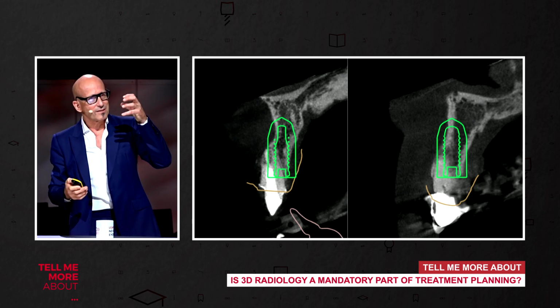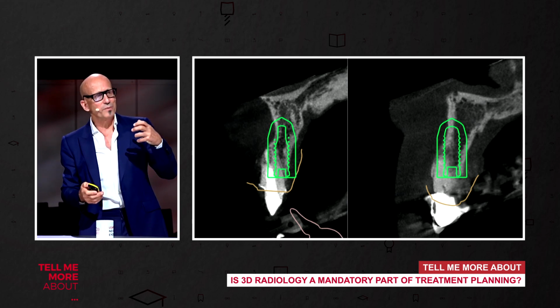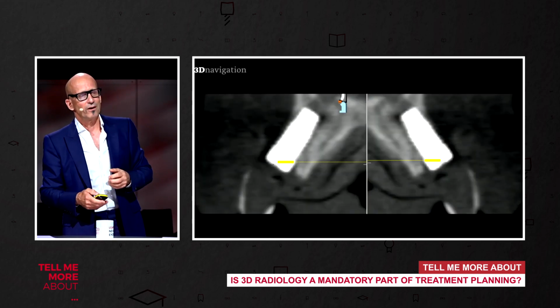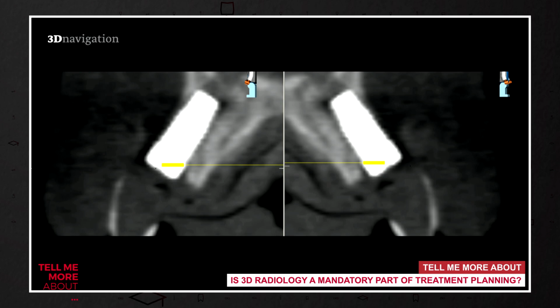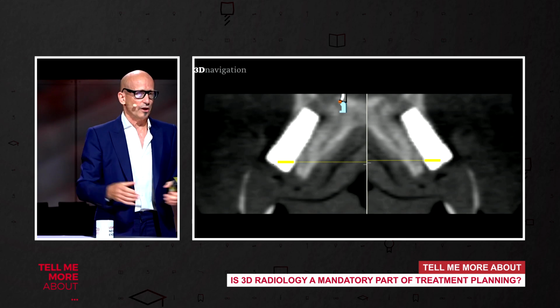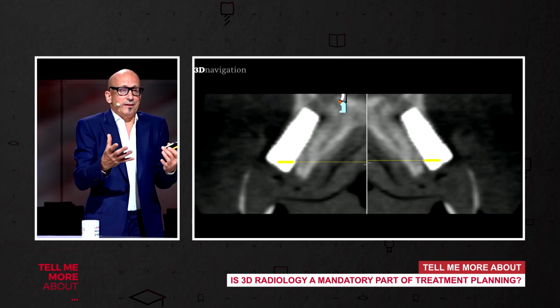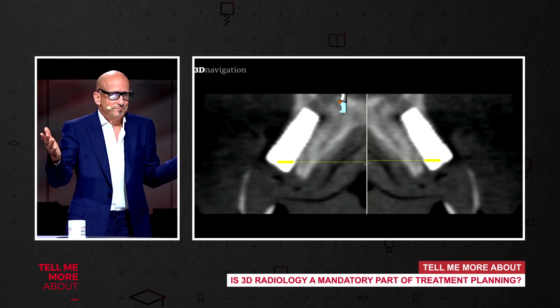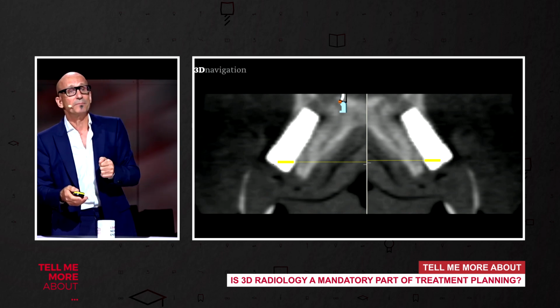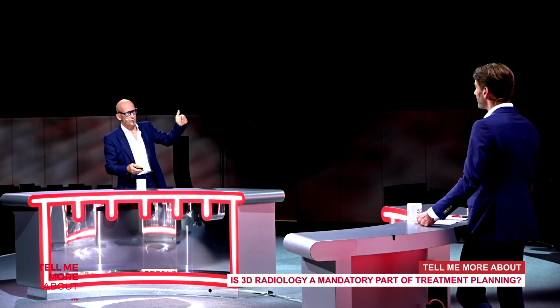So having this analysis allows me to achieve the best implant position in this area in a better way. And those things don't happen. Once this patient showed up and had, 2 weeks ago, immediate implant placement in the aesthetic zone, and there is no buccal bone anymore, and everything is lost, and the dentist just placed the implants free-handed. And so these things we need to avoid. This then ends up over the years in a catastrophe.